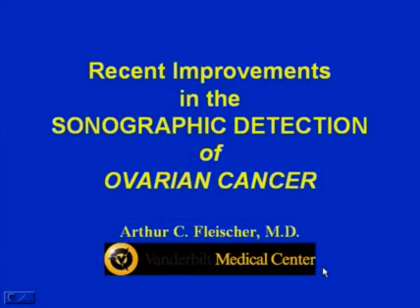This presentation will cover the recent improvements in the sonographic detection of ovarian cancer. I want to give a tribute to Dr. Barry Goldberg, who has helped guide some of this research and certainly has helped me in my quest to develop new techniques in ultrasound.